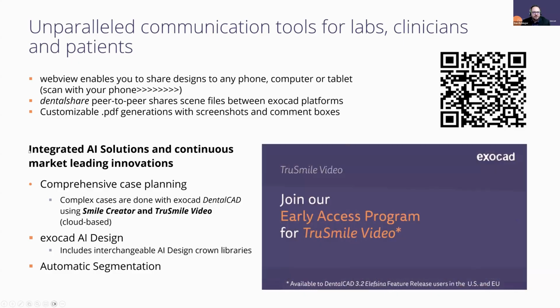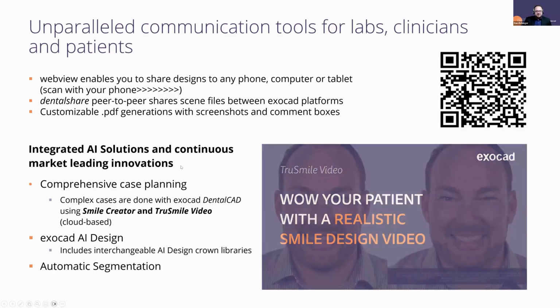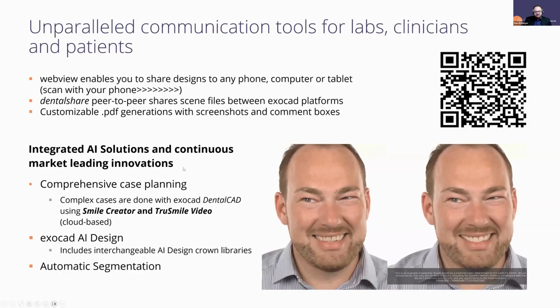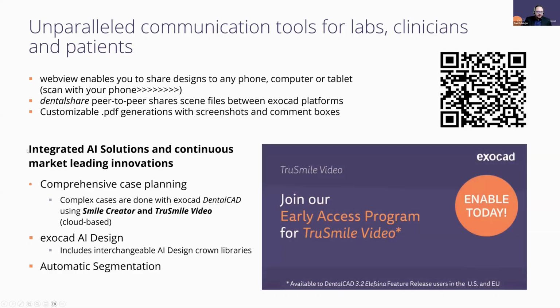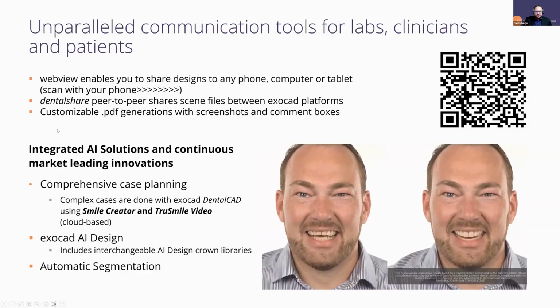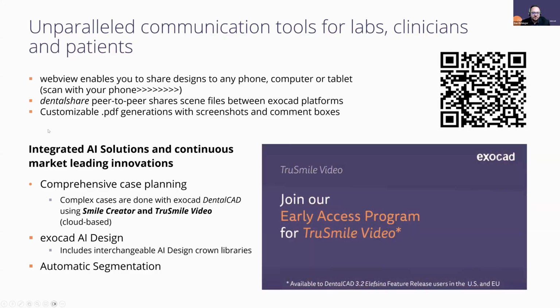So for all those patients out there that are somewhat indecisive like myself with moving forward with treatment plans, it's a big investment on the patient's end. When you're thinking of thousands of dollars to improve your smile and your aesthetics, this really leaves out any room for imagination.